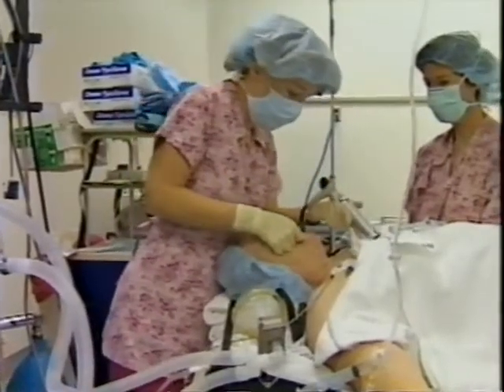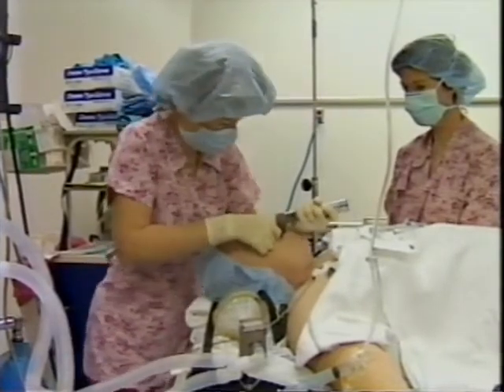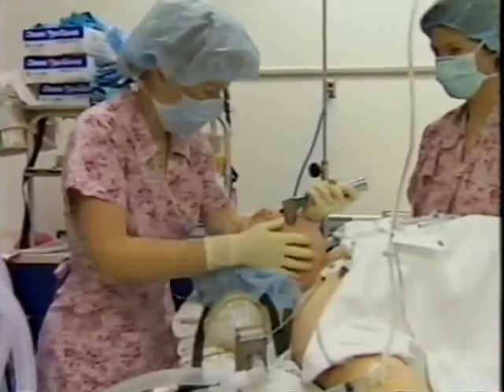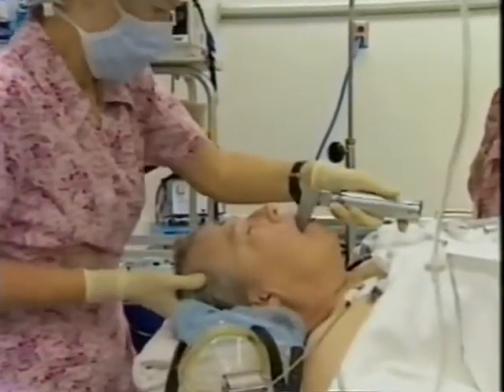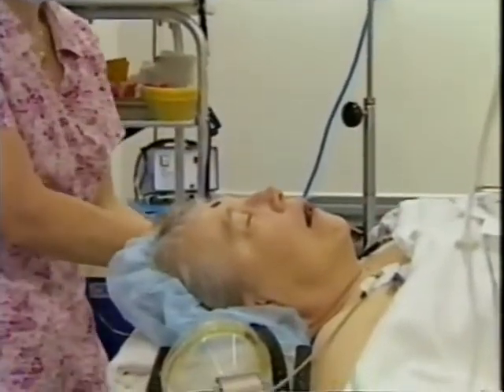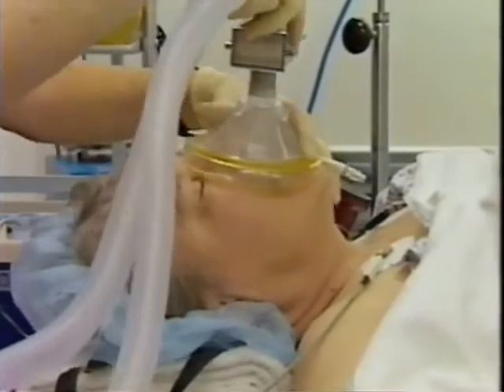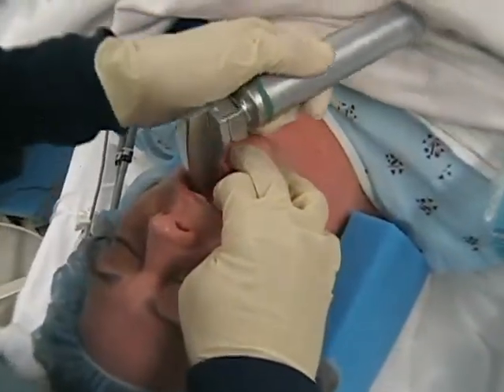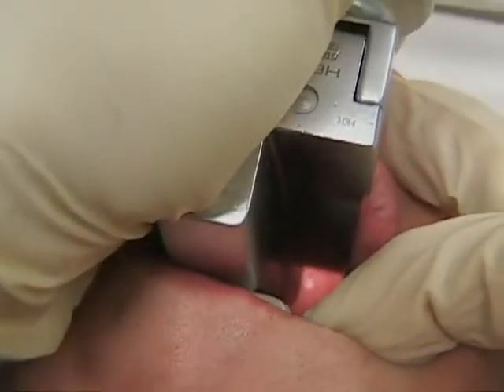Although a few patients are difficult to intubate because of their anatomy, error in technique commonly causes difficult intubations. First, it's normal to be nervous. Don't let it interfere with your ability to act. The risk of injuring the patient is low when you ventilate the patient between attempts and use gentle technique. If the head is not optimally positioned, the larynx may appear more anterior on laryngoscopy. Cricoid pressure may help.